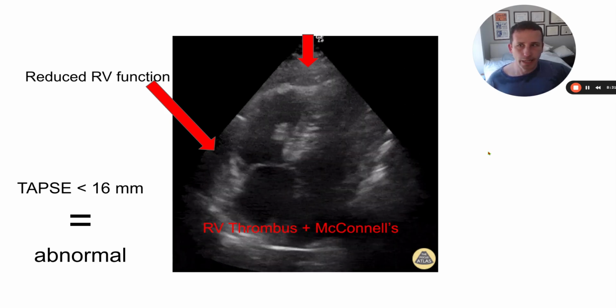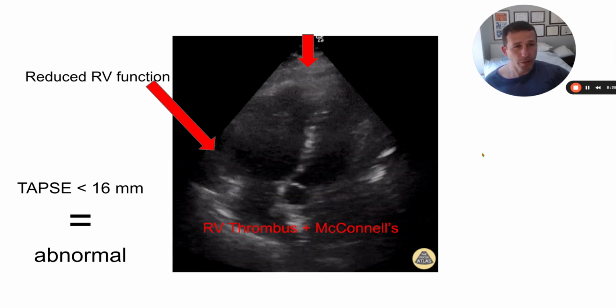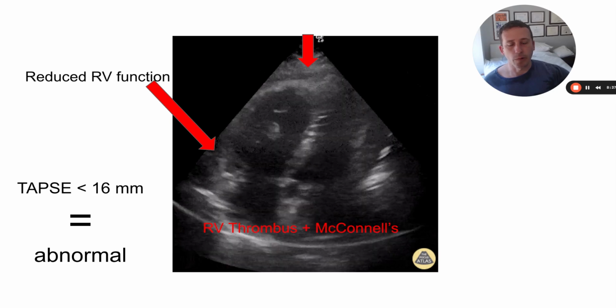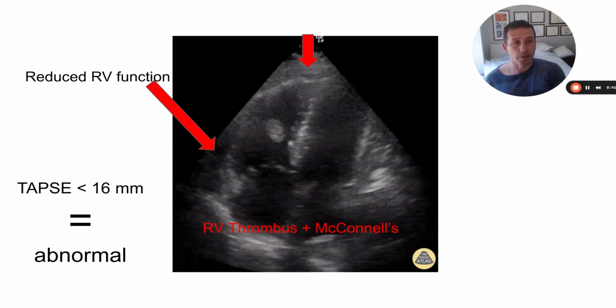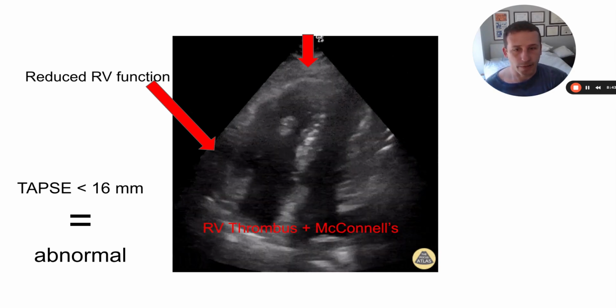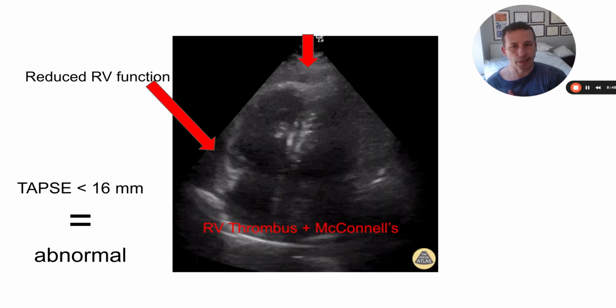And that's it. Get to scanning. You guys can practice obtaining your sub-xiphoid views, trying to freeze and measure that RV free wall, and then additionally trying to get your apical 4-chamber views, maybe even try some apical 5s. And if you'd like, you can try also measuring some tricuspid annular plane systolic excursions.